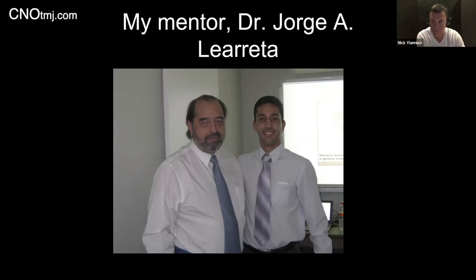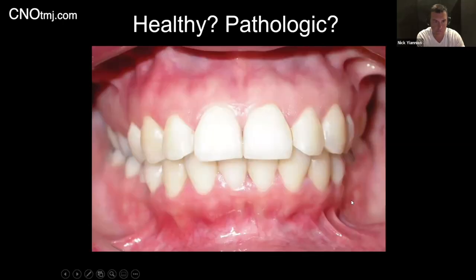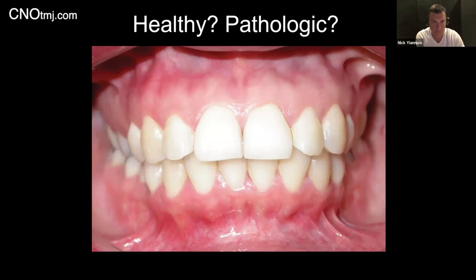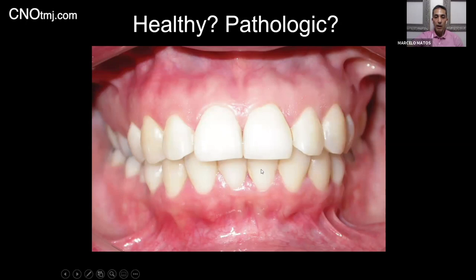So usually when we think about vertical dimension, we think about this in terms of conventional dentistry. We look to the mouth looking for an upper arch covering the lower arch to some extent. But if we think about that, we don't have any data on the health status or the pathological status of the system. A person may have this occlusion relationship and be very healthy, or maybe the person is very pathological in terms of joint. But how to know that?